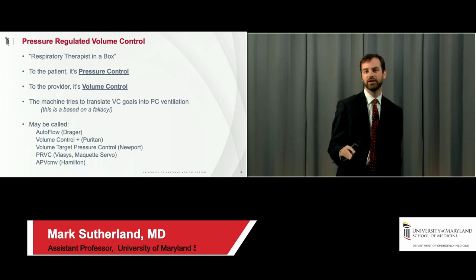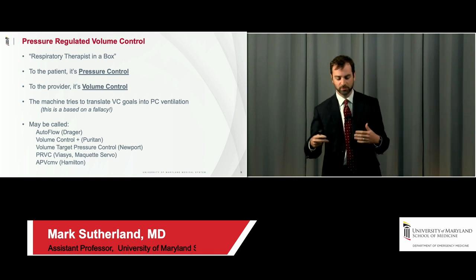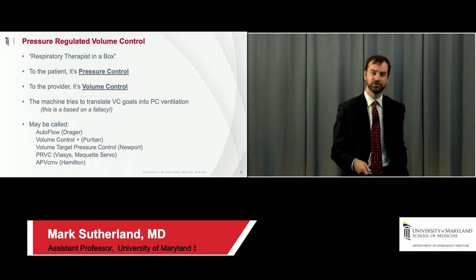And it was marketed as this quote-unquote respiratory therapist in a box, was kind of the way it was phrased. So the companies would go out and market their variant of PRVC as a respiratory therapist in a box. You can just set it and forget it. And I think that causes some problems.